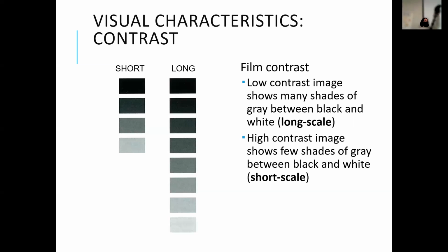So this scarf here would be an example of what? Long scale, low contrast, because there's lots of different shades. Well, there's really only so many, but it's a scarf, so it's really, really long. So hopefully that might help.